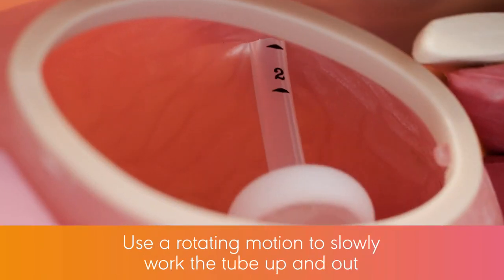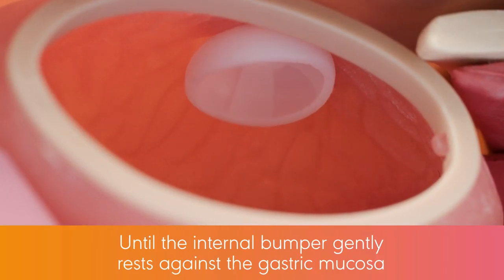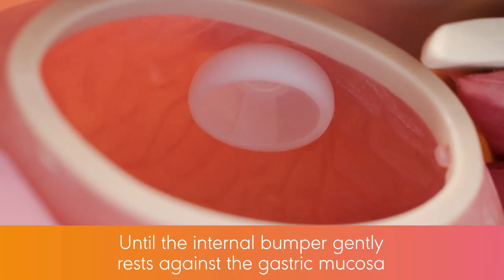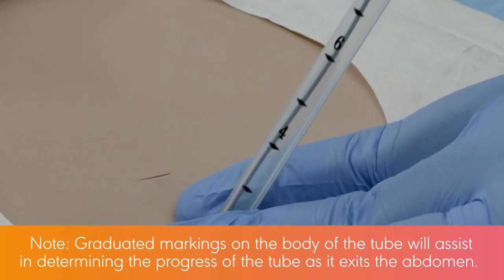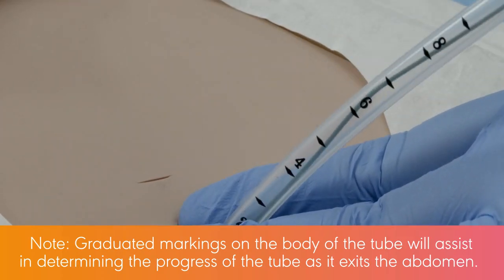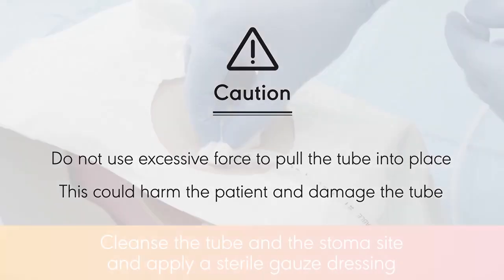Use a rotating motion to slowly work the tube up and out until the internal bumper gently rests against the gastric mucosa. Note, graduated markings on the body of the tube will assist in determining the progress of the tube as it exits the abdomen. Caution: do not use excessive force to pull the tube into place. This could harm the patient and damage the tube.